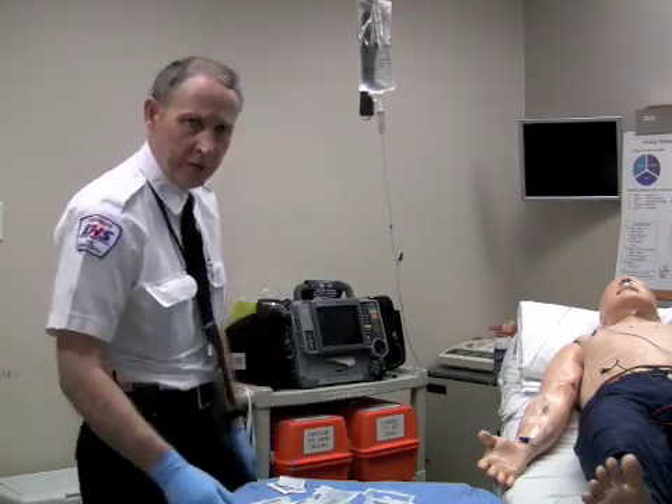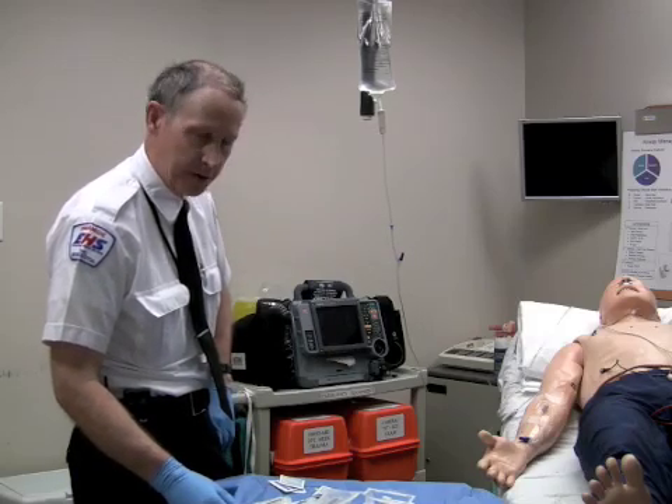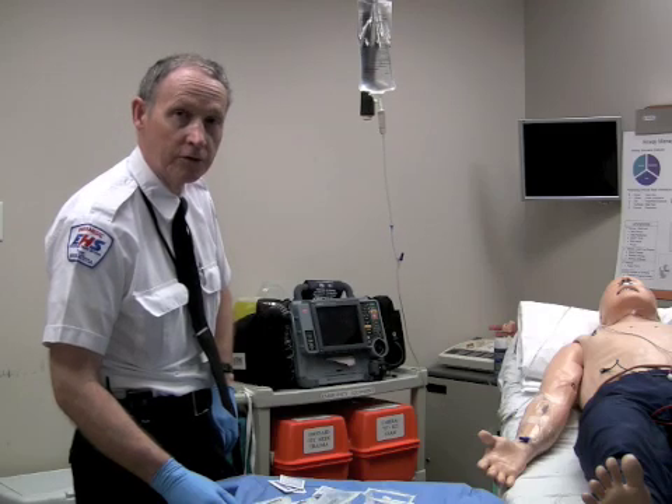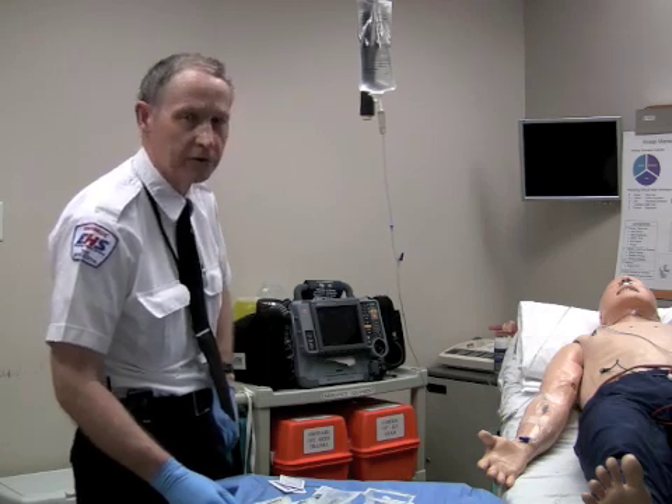Hi, before we get you into the lab practice giving adenosine by administration, we just want to spend a couple of minutes here demonstrating the use of the three-way stopcock as an expedient to administer adenosine.